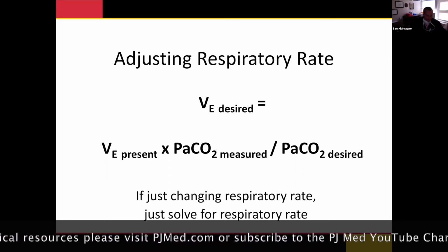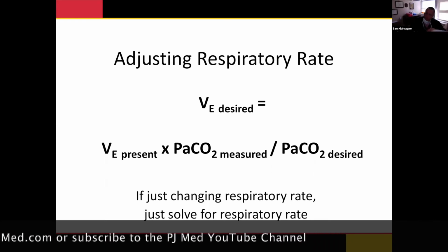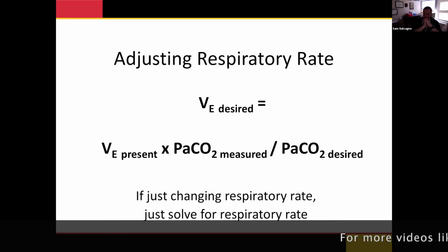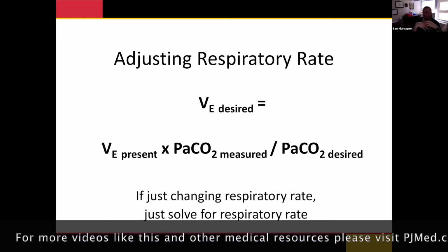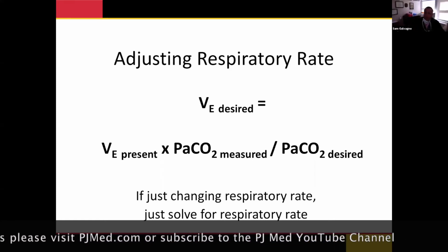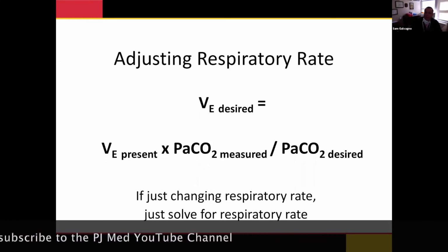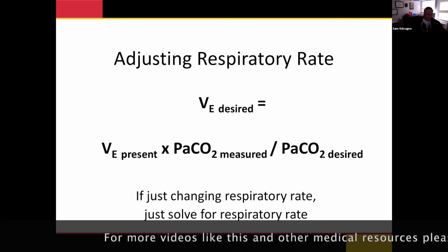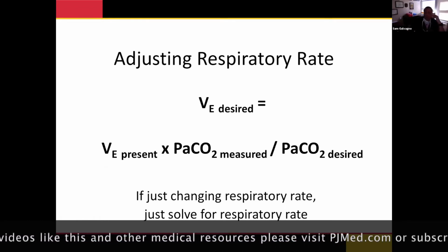Let me know what your answer is. Any takers? Yeah, like 23, 24. Okay, yeah, that's to really blow it down. And you know what? You don't have to go that high. You could even just say, all right, I'm going to go to 20, and then I'll check a gas or follow my end-tidal CO2 trend. But it's definitely higher than 12, right? For sure. So that's one way you can be a little more precise about this, okay? And you don't always have to correct to normal.